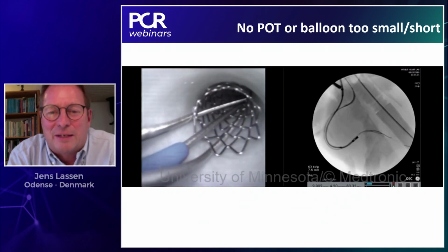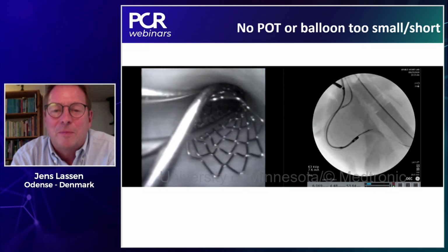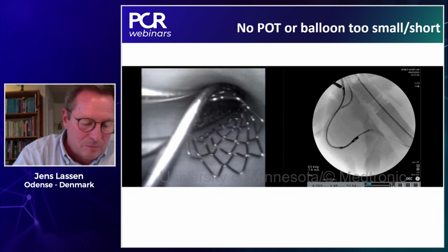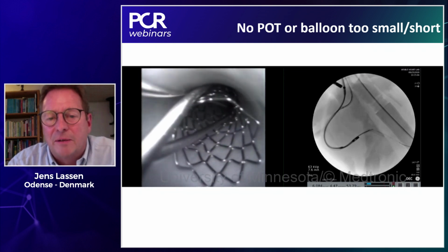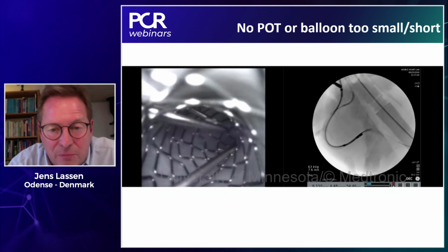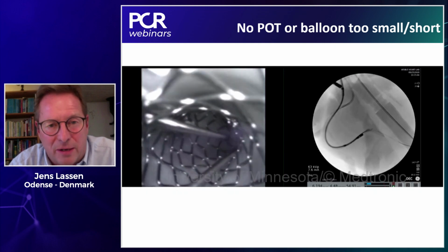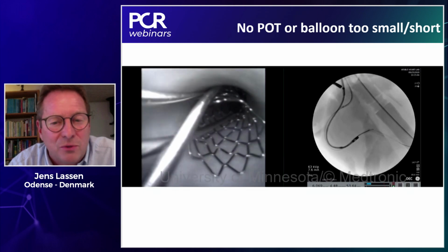Thank you very much, Dejan. And as we can see here, we have implanted a stent with respect to the distal diameter, which means that the proximal part is floating. We can see the jailed wire, but we can also see a wire passing below the stent struts. And there we can see it goes behind, and it's very easy to see it goes inside and then out again in the side branch. So try to imagine what will happen if we inflate a balloon over this wire. We will cross the stent in different areas and enlarge it in others and make a huge mess of metal in the vessel.